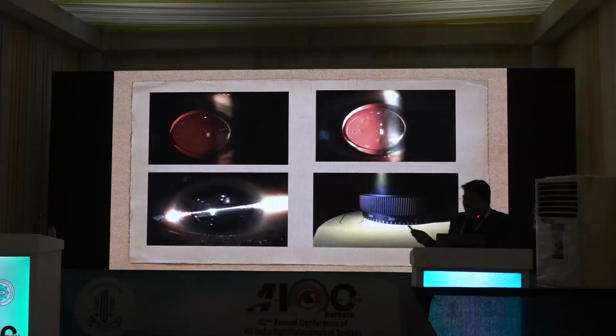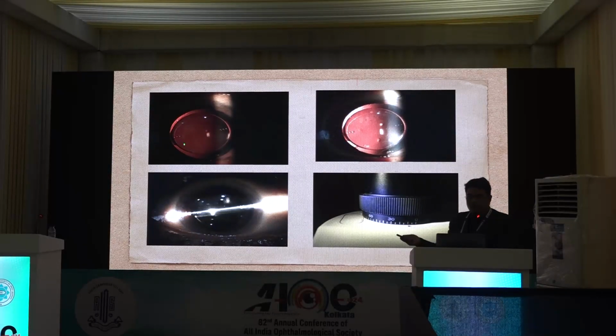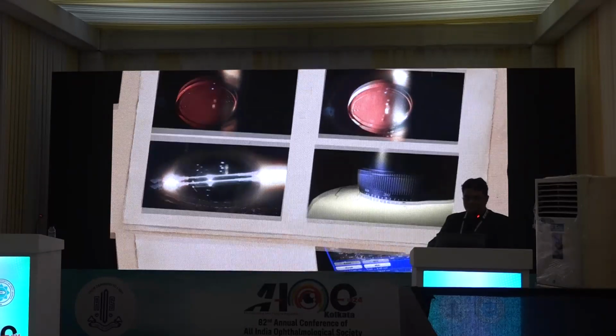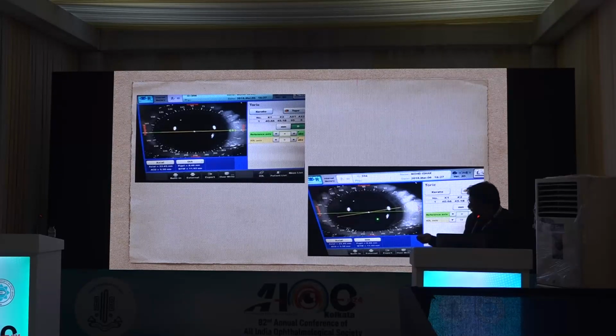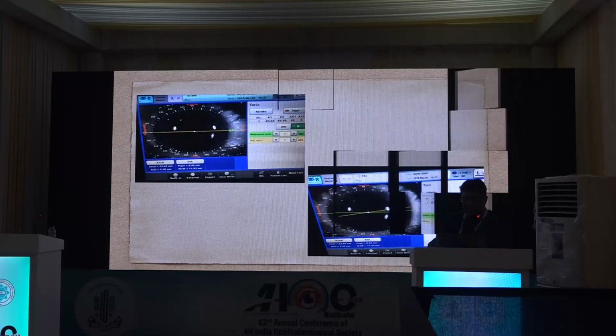So I go ahead and dilate the patient and check where the toric IOL is now sitting. I check and yes, it's at 10 degrees. So the toric IOL which the surgeon implanted at 10 degrees is at 10 degrees, but still he has a refractive surprise. So I go ahead and check on the optical biometer. It shows me that the IOL axis is at 10 degrees.